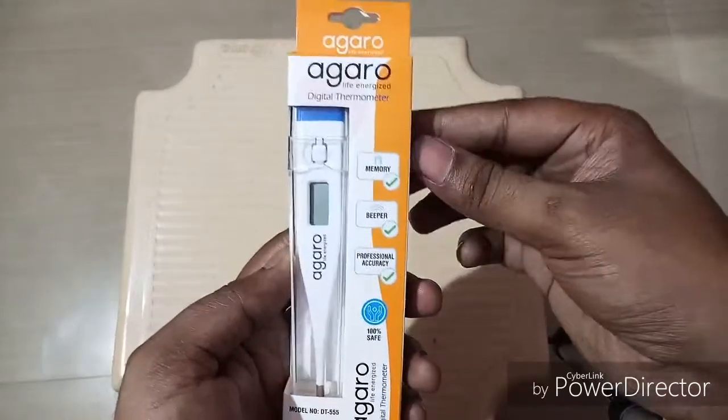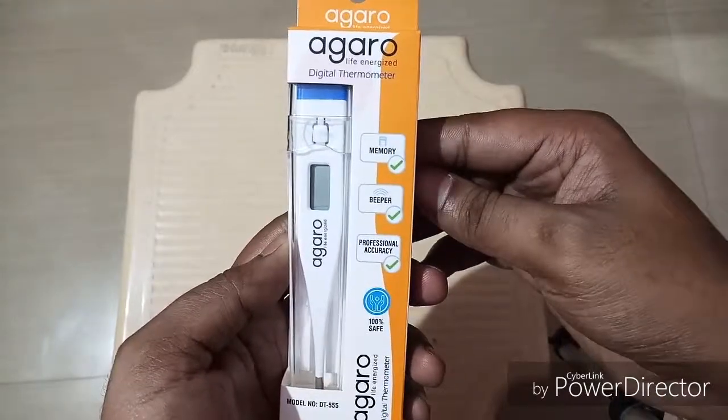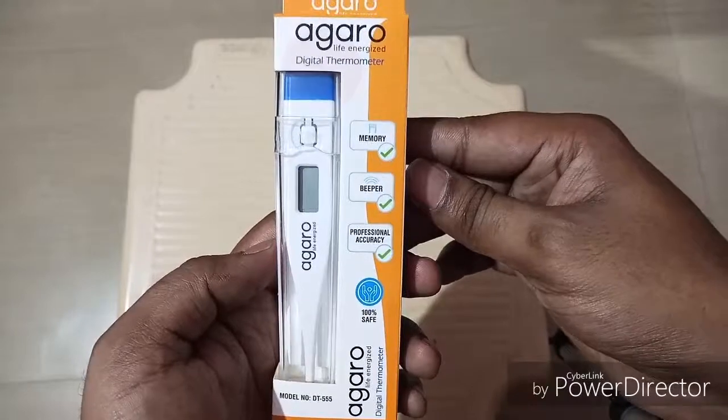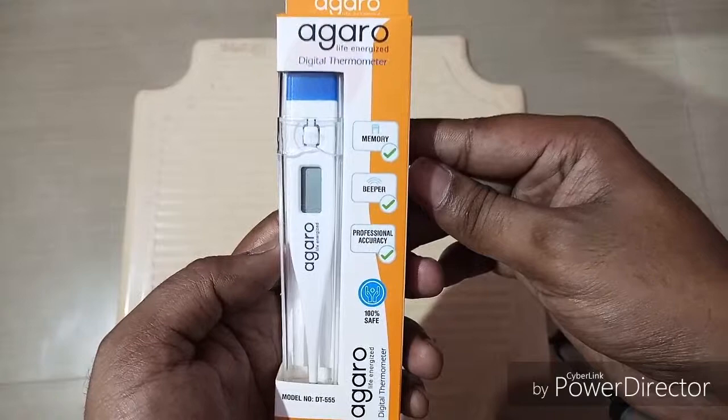You can see this is a brand called Agaro digital thermometer. The Agaro digital thermometer is nowadays very famous — you can see most hospitals, clinics, and doctors are using this digital thermometer.